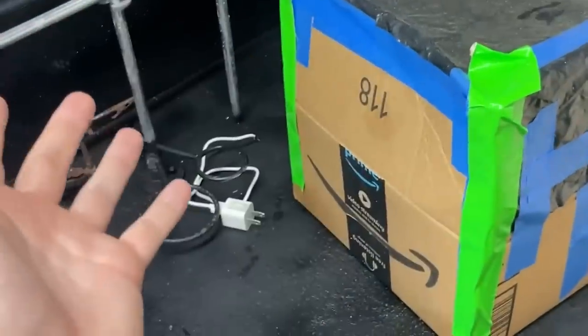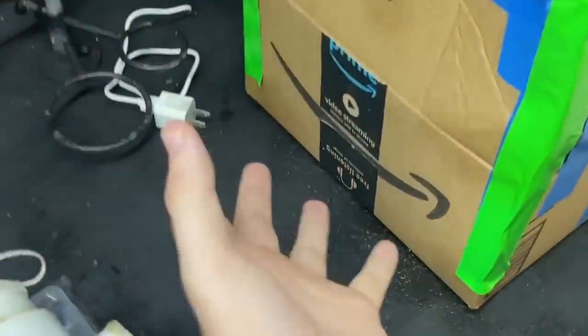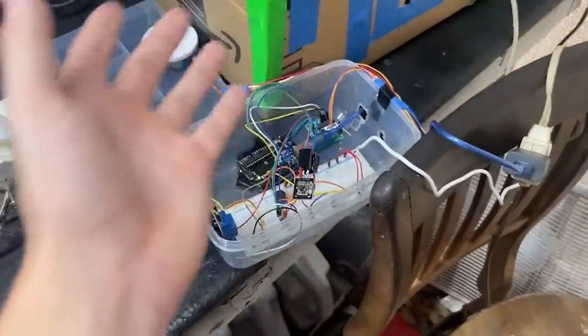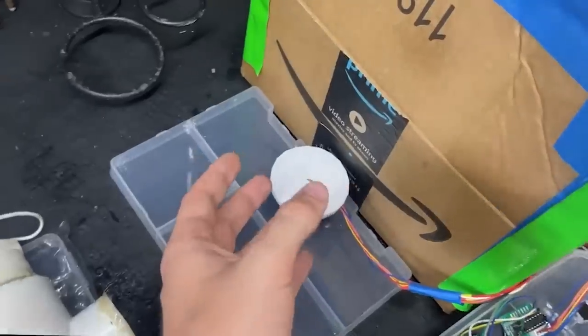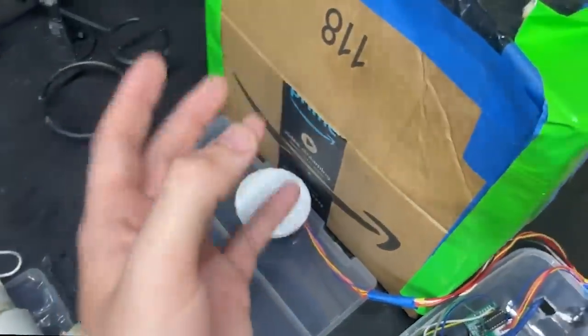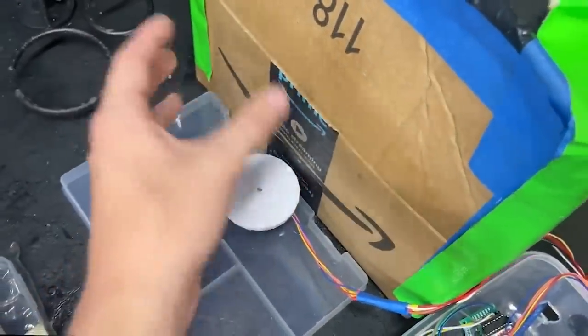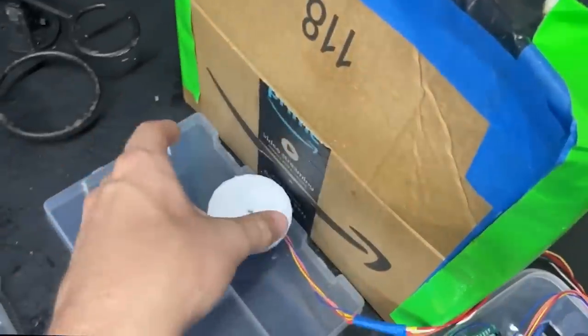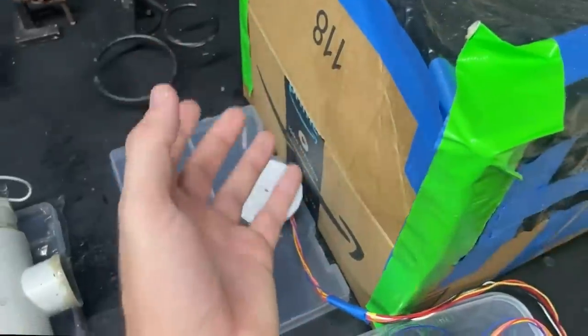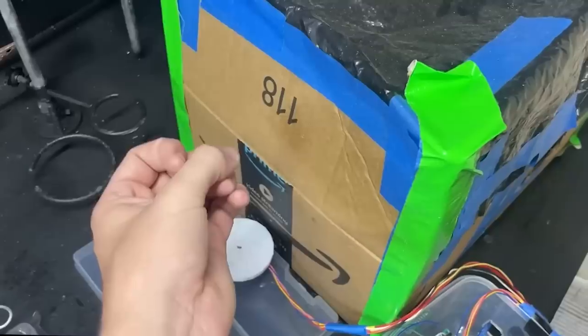Right now this is just a normal x-ray machine — we're missing one super crucial part: the Arduino. The Arduino is going to turn this simple x-ray machine into a CT machine. The main component is the stepper motor. We take an x-ray, it rotates 8 degrees, take another x-ray, rotate another 8 degrees, and repeat until we get a full 360 degrees. That gives us all the data we need to create our CT scan.